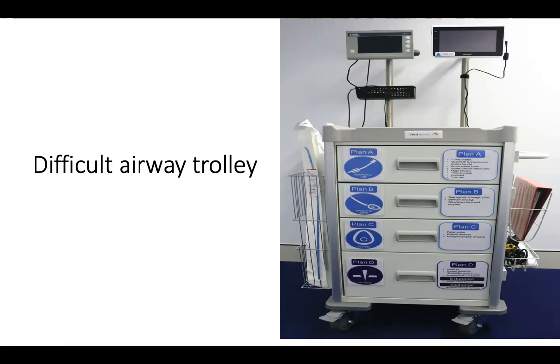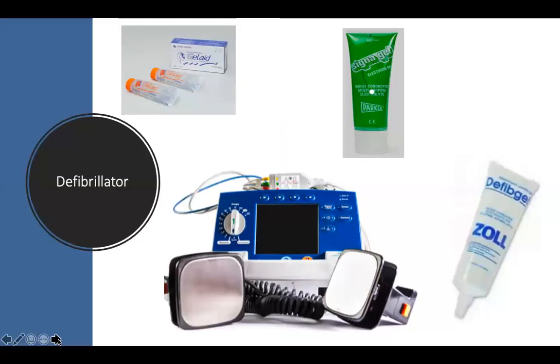I know it's difficult in some hospitals, but you have to speak to the matrons to try and push for that, so that you have your own suction and you don't share with the surgeons and they have their own suction. Another thing also that Dr. Folokwe did outline is you must make sure that you have enough vacuum on that suction. Otherwise, it's not going to be effective. So that's a few words on suction.